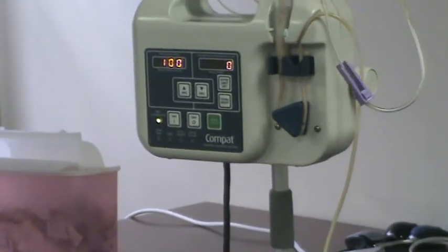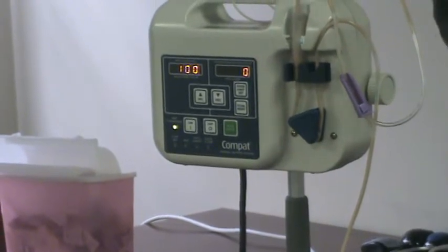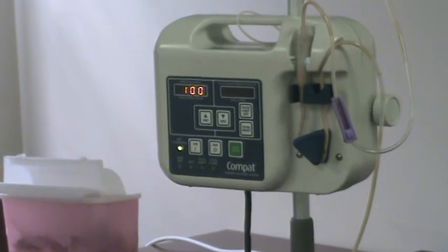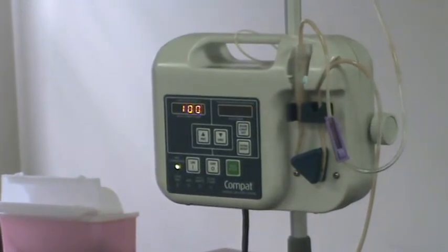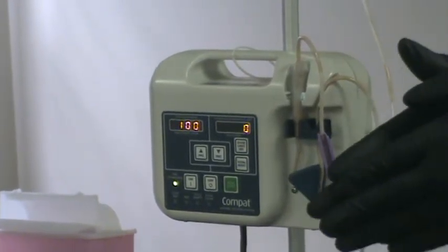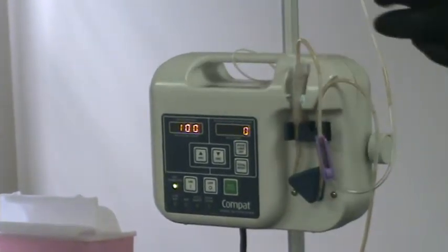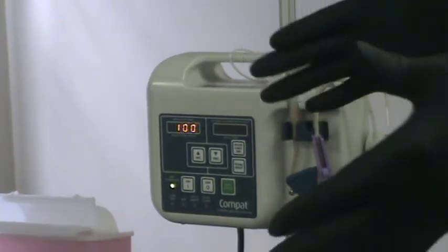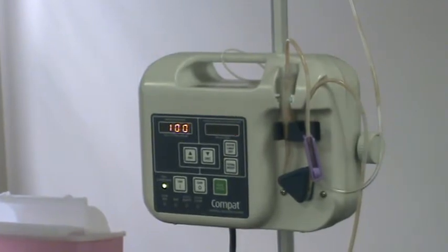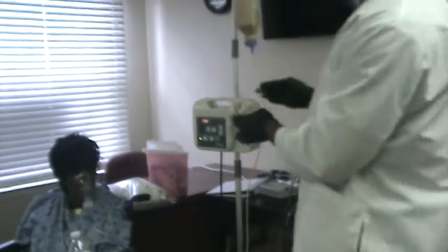So now that we finished the connection, it's just to run the feeding. So you would start the feeding at the time that you're supposed to start the feeding. So we're assuming it's 4 p.m. for her order. They tend to give the feeding in the evening into the night time, so that in the morning she's done with her feeding for the day. She can go to an appointment or attend activities without having to have the connection, the feeding with her. So we always run it in the night.